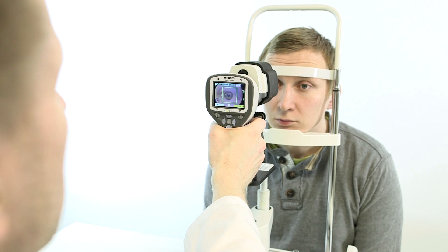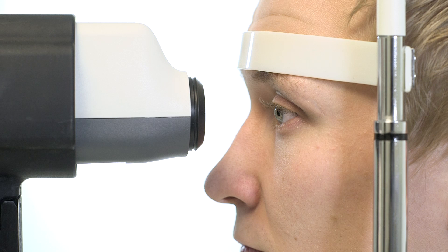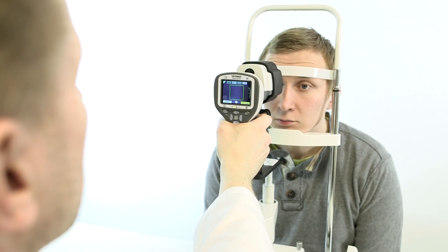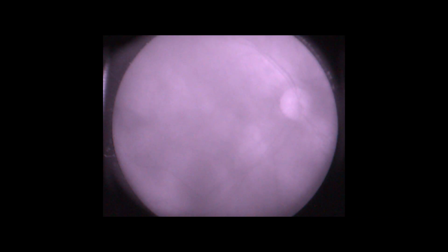Start approaching the eye from about 10 cm distance. Keep the pupil in the center of the display and approach until you can see the reflection from the retina, which appears grayish with infrared light. Keep the view of the retina in the center of the display and close in slowly until it fully fills the viewing area.